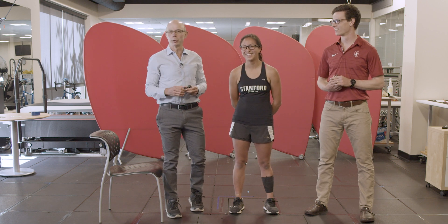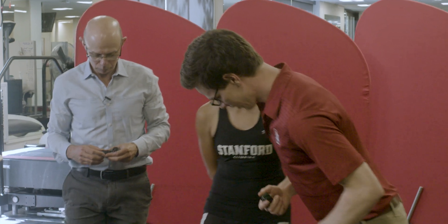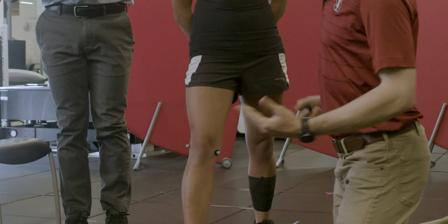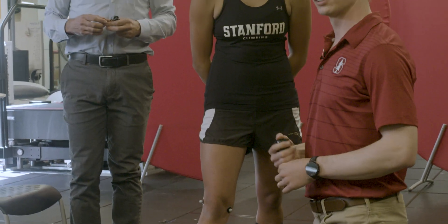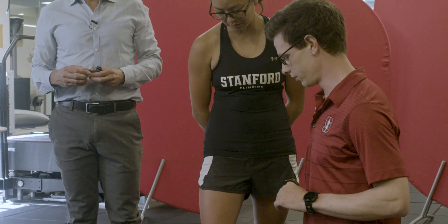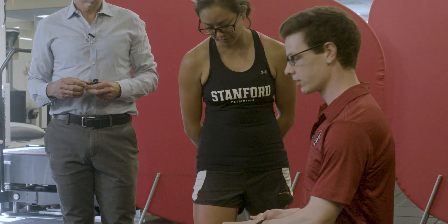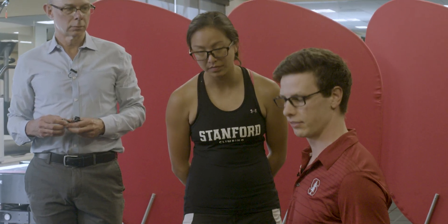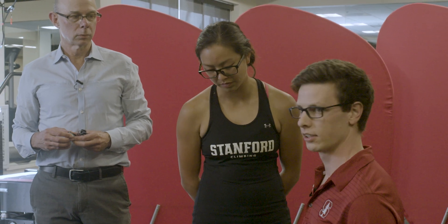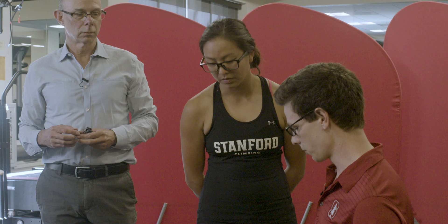So let's go through a quick experiment of how we'd get set up. We're going to place four electrodes today — typically we might do eight or nine on a single leg — but the first one is the tibialis anterior on the front of her shank. Before we put the electrodes on, we want to prepare the skin: we would shave and wipe it off with alcohol to remove any lotion or grease to get the best signal quality.